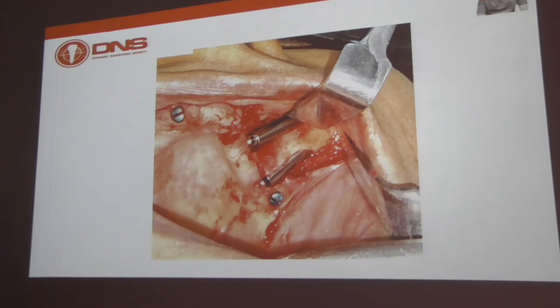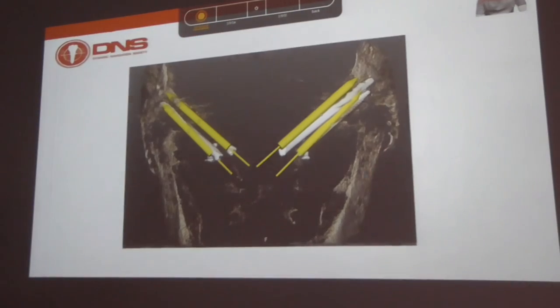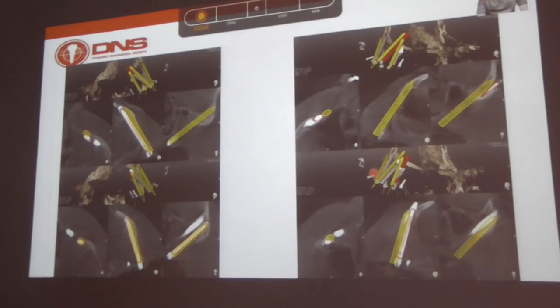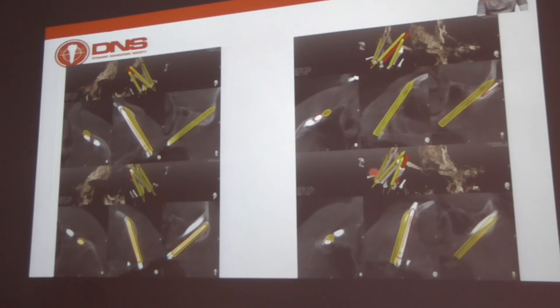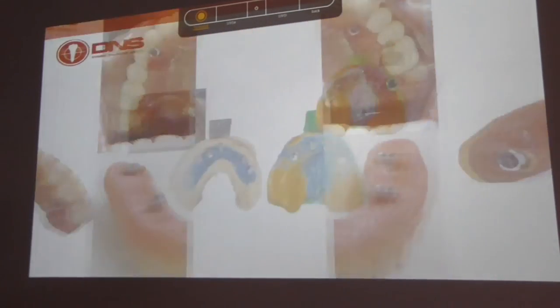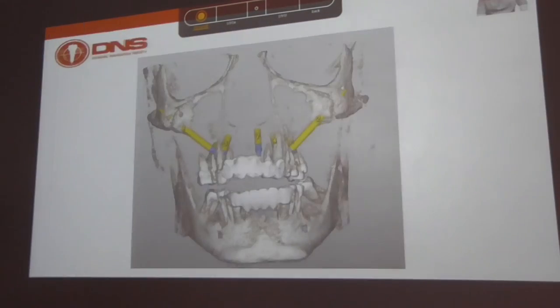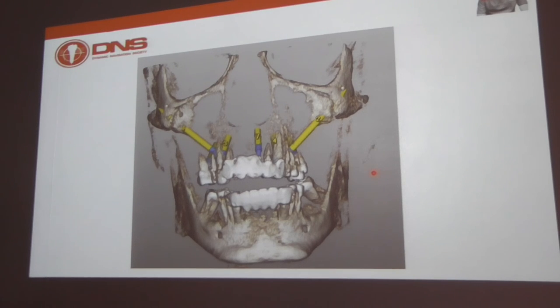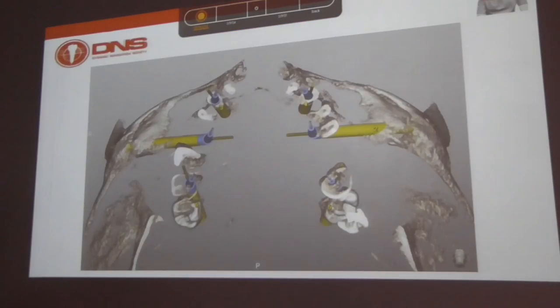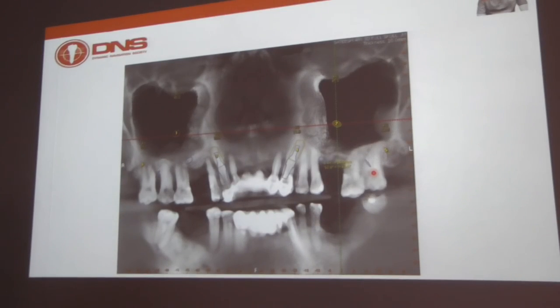So these are the zygomas placed, on both sides. This is sutured. This is the wrap done. And now is the immediate loading protocol, but I'll just skip through this. Just finish the case, take the final prosthesis, and this is the next case with pterygoid: two zygoma, two pterygoid, and three conventional implants. Zygoma steps remain the same.